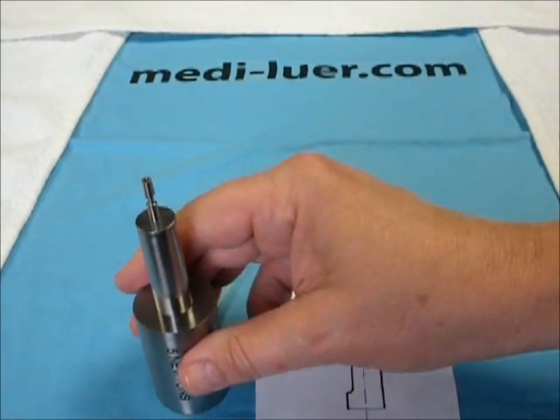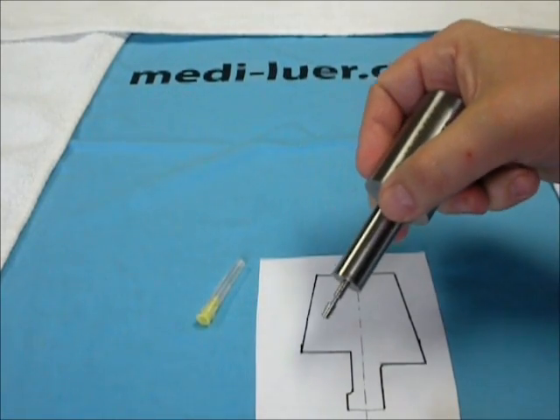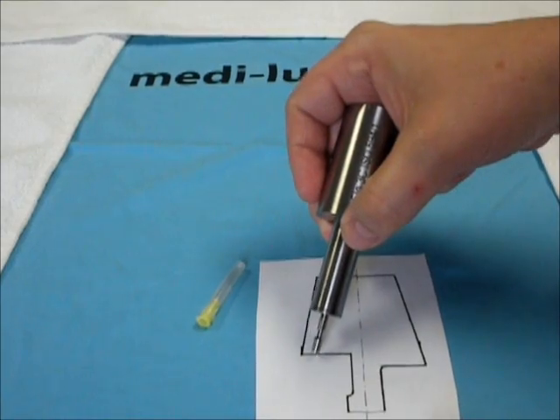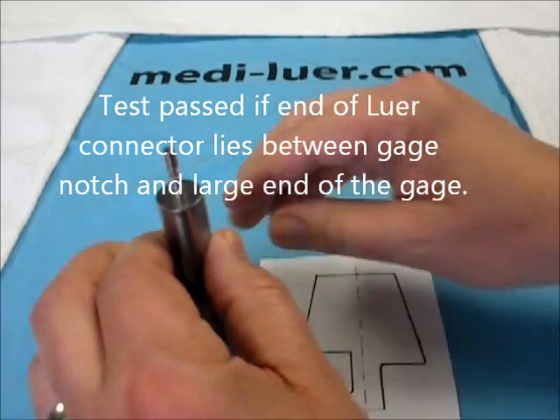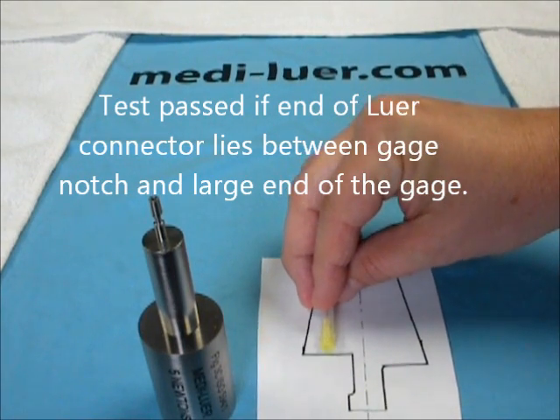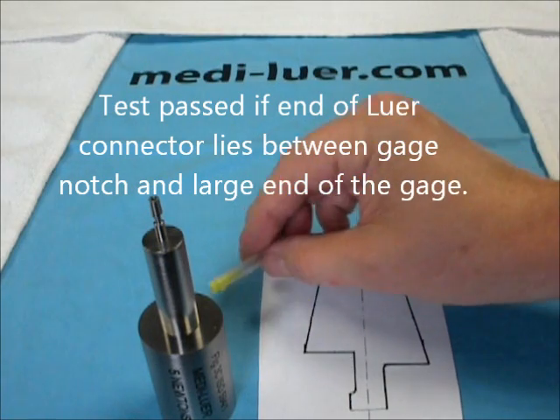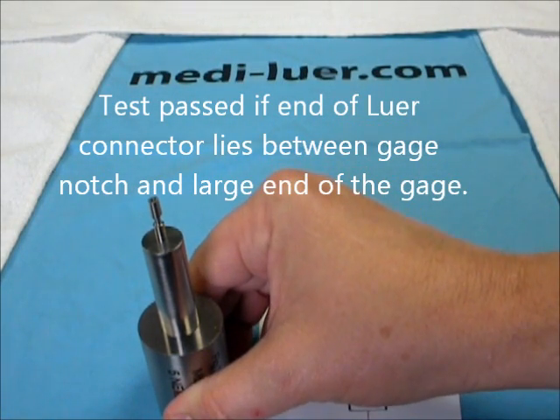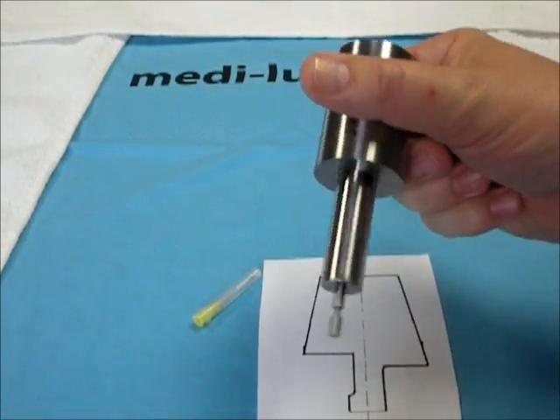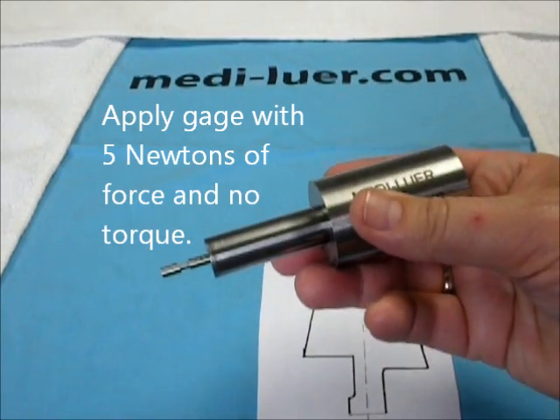You will notice that the gauge itself has a notch cut onto the end of the gauge — so you've got the end of the gauge and you've got a notch. The goal of the test is to have the end of the test piece fall between these two surfaces of the gauge. The ISO 594-1 tells us to use this gauge with 5 newtons of force and no torque.